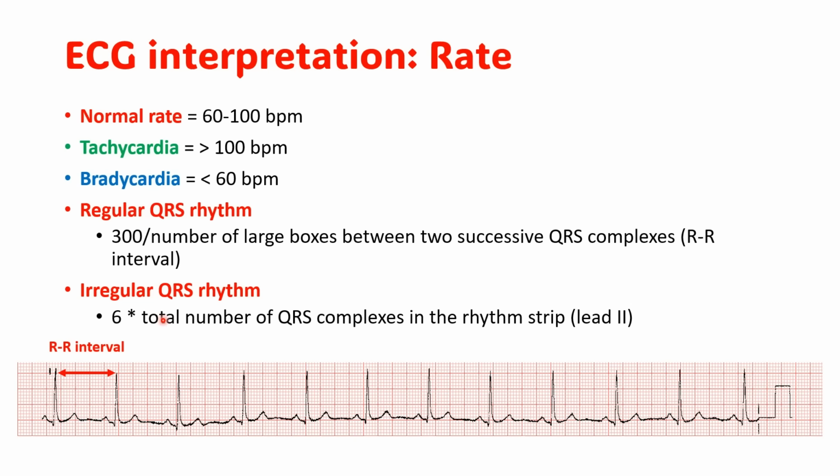Okay. The methods I've just mentioned of determining ventricular rate, atrial rate can also be calculated by doing the same for the P waves. Atrial fibrillation is a good example where atrial rate and ventricular rate can significantly vary because atrial rate can be anywhere greater than 300 beats per minute, and the corresponding ventricular rate can be slow because you can have slow AF, or it can be very, very fast, typically in young people.